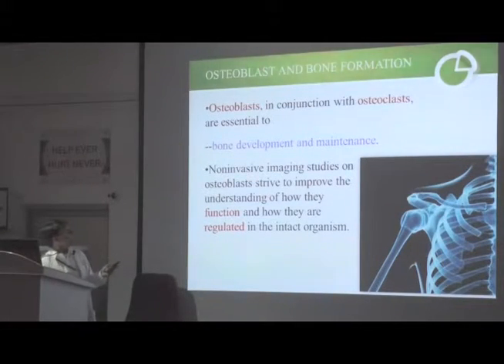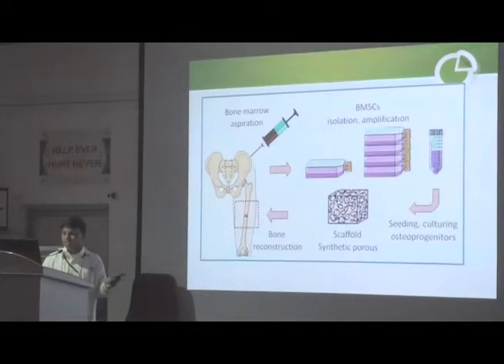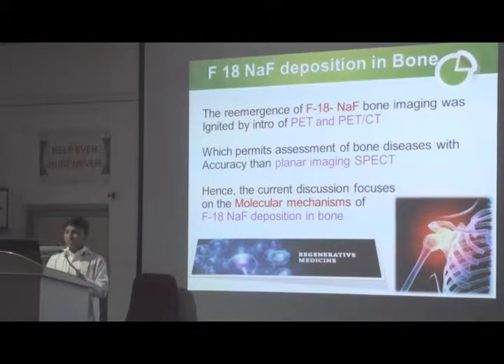It can also image the osteoblast and bone formation. In conjunction with the osteoclast, they are essential to bone development and maintenance. Non-invasive imaging studies on osteoblasts strive to improve the understanding of how they function and how they are regulated in intact organisms. Here, F18 NaF deposition in the bone.